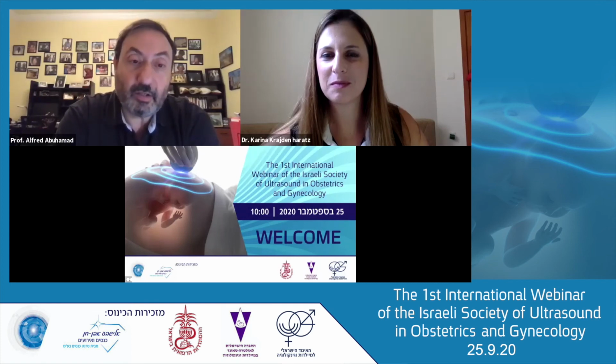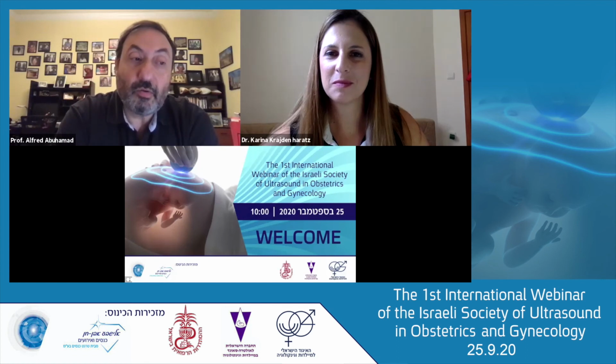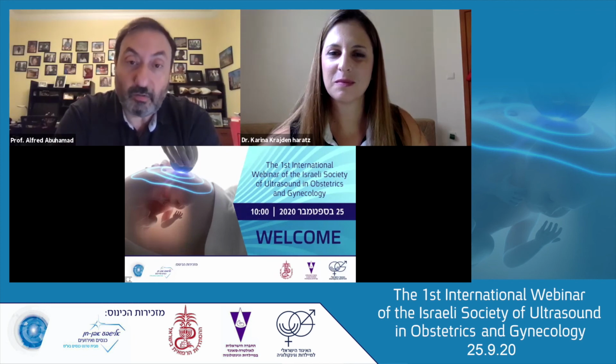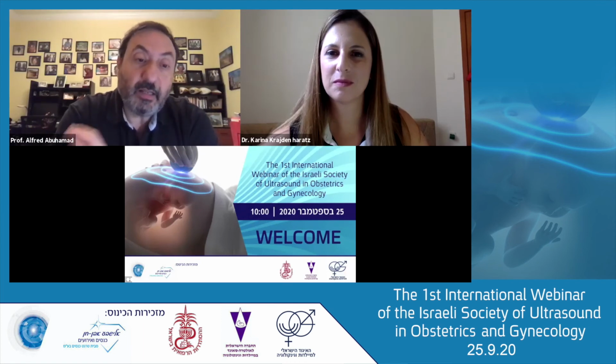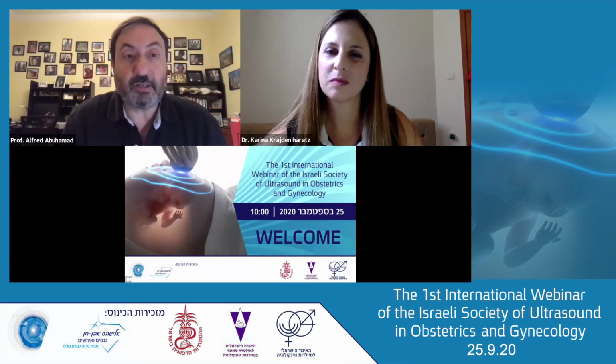And I will tell the group that are on the 14 to 17 weeks that there are new guidelines that were just released from the AIUM, I think last week or 2 weeks ago, on the detailed first trimester ultrasound exam. These guidelines are in the United States indication driven, because we still have to find an indication in the US to do the first trimester screening, unlike in Israel or in Europe.